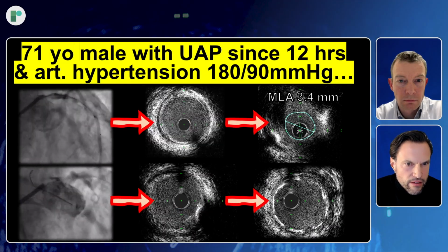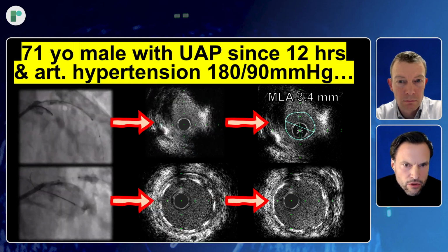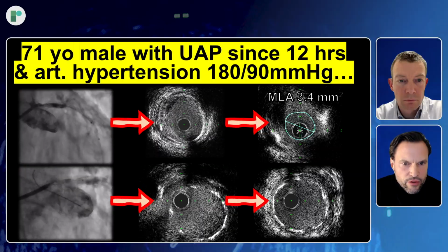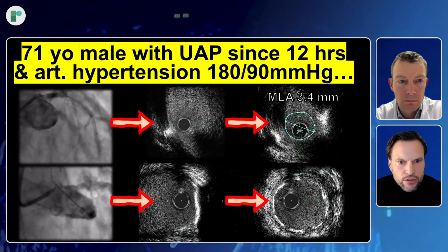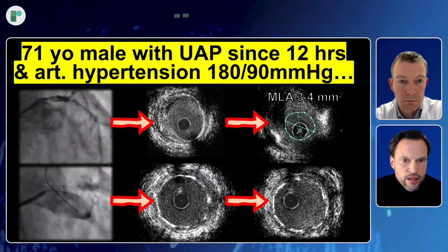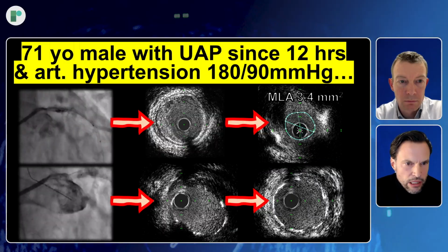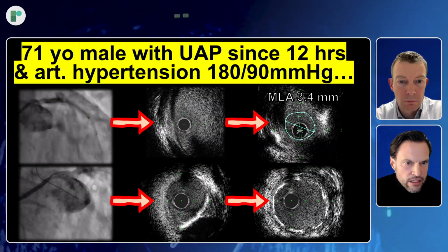And yes, it's important to have the information from IVUS, not only to define the severity of the coronary artery disease or the stenosis, but also to plan the procedure, to size your stents, maybe to upsize your stents, to think about bailout strategies, for example, to appreciate the amount of calcium and so on, and then you can have a good result. Normally, an ostial left main is a simple lesion, but it can be very complex if you undersize your stent in this situation.